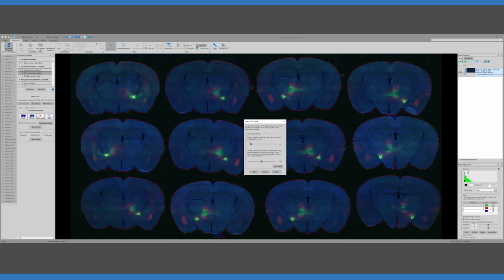Yeah, so the goal is, as Chip said, to define the outlines of each section. When you're looking at whole slide imaging, usually each section is pretty well separated from the background, so it's fairly easy to separate them out. But here, in particular, we're paying attention to the boundaries, the edges of each section. There are 2 controls that you can use to change how those contours are generated. The first is smoothing, so that's the parameter that you're looking at right now.